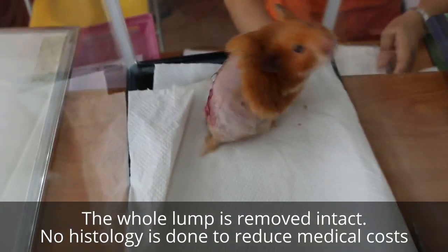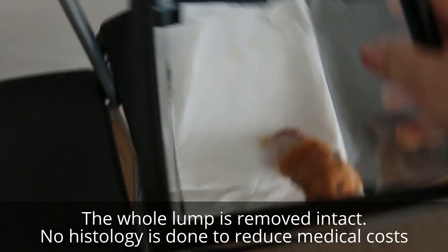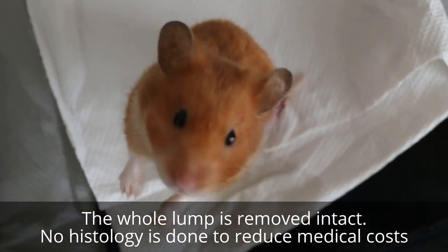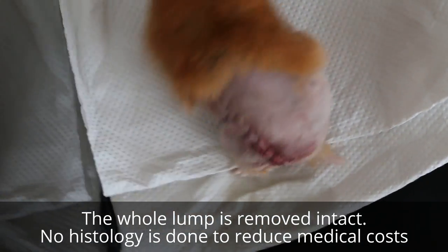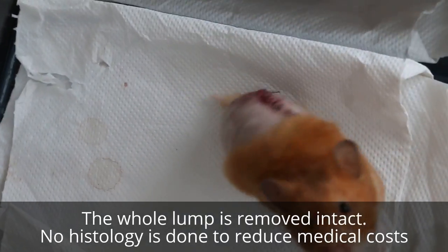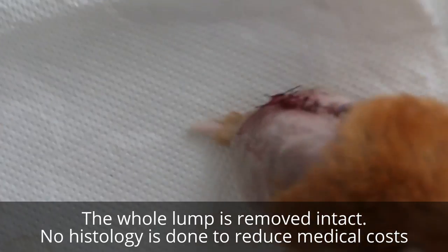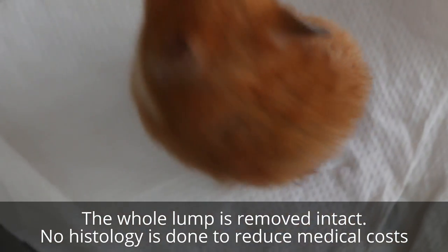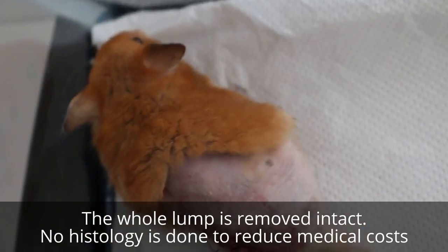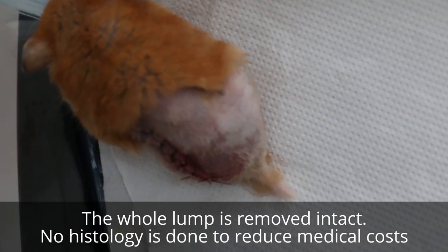I'm sure it's okay. So give isoflurane gas to effect. The assistant must be very good so that the hamster wouldn't die from the isoflurane gas. Then I excise the tumor by blunt dissection and pull it out. There was little bleeding. I ligate one vessel, and overall it looks okay. Now it's 2 hours post-op, so we'll be going home soon, with antibiotics and painkillers.